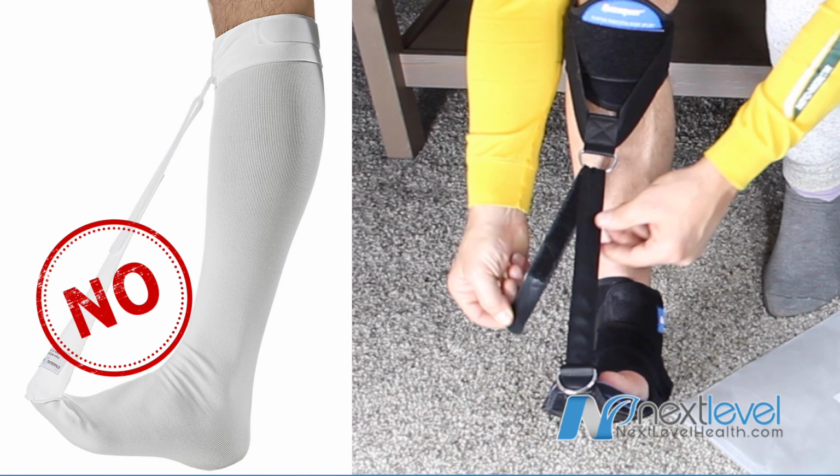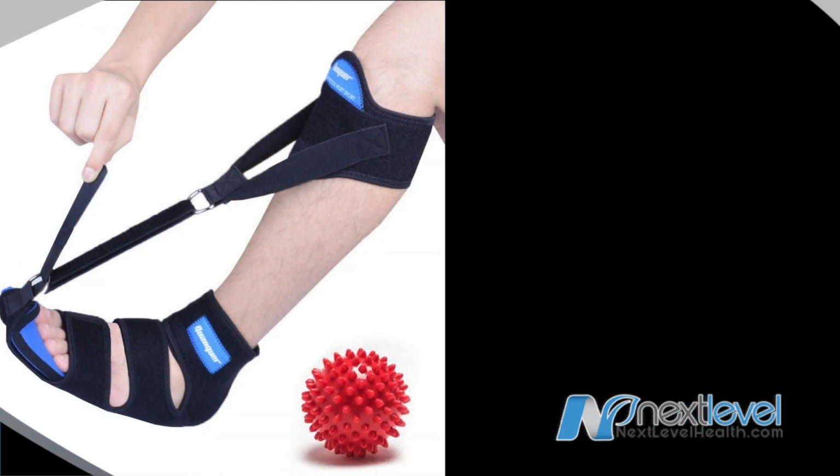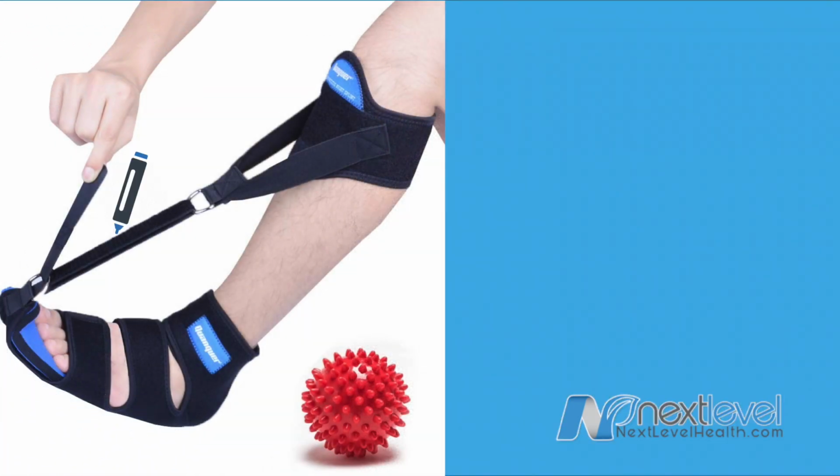So when you begin, notice where your tension is tolerable, and you can actually maybe even mark on there with a light marker or a white marker your progress along the way. And if you feel like this is just not enough tension, we want to crank it up even a bit more. There's another way to do that.